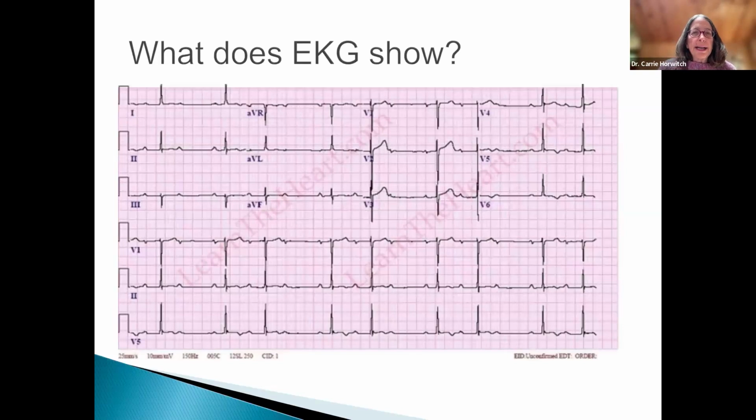So does anybody want to see if you can figure out this EKG? Again, rate, rhythm, axis, the intervals, and then elevation or depression.